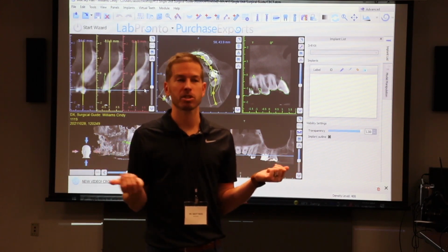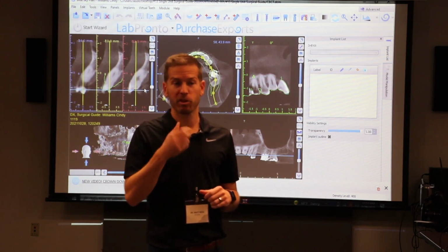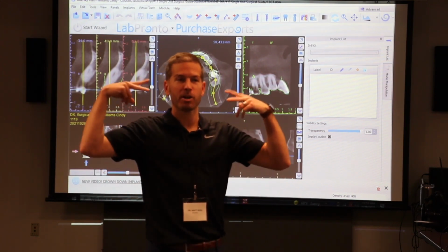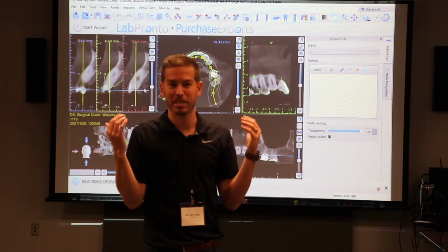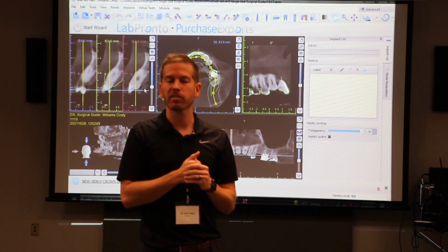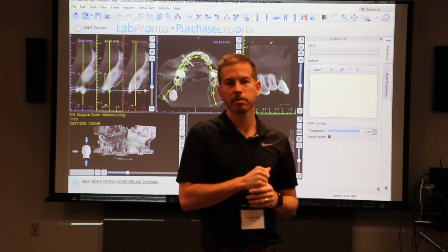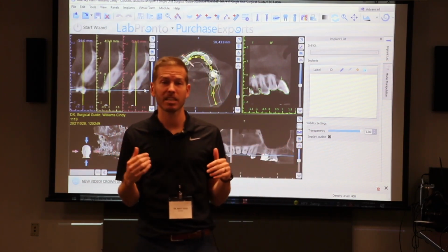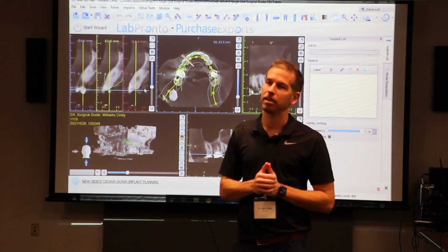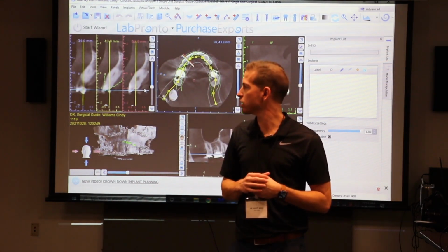But if they have a bunch of zirconia crowns, sometimes you have to make a tray with impression material with radiographic markers outside the tray and use those that are away from the teeth. Do you follow that? So you have to creatively solve those problems, and it's a little bit more complex to do that. That's why, thankfully, 90% of patients have some natural teeth to stitch to, and you don't have to worry about that. Yeah, most of the time you'll find that these will just stitch.